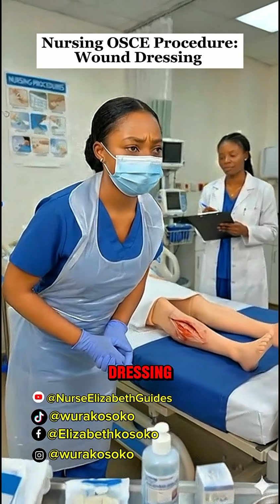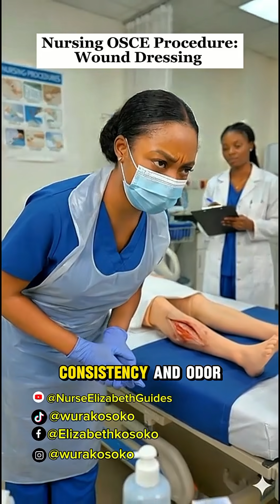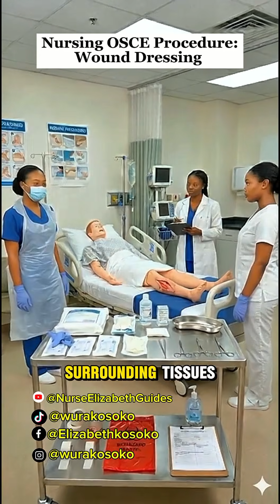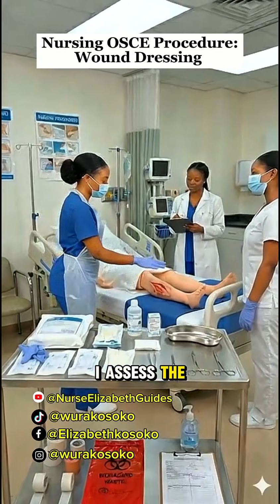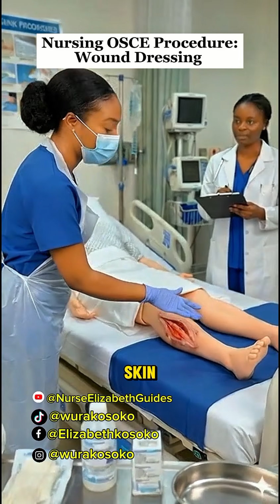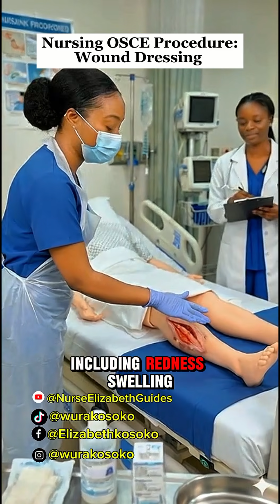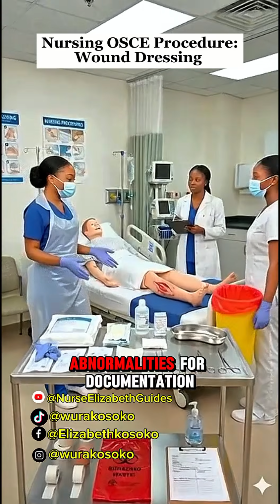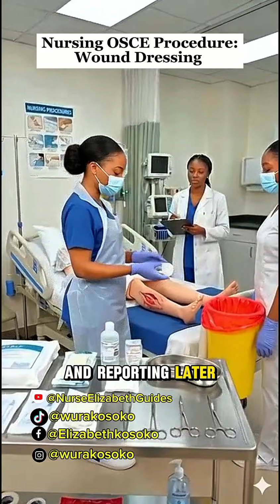While removing the dressing, I observe the amount, color, consistency, and odor of any exudate. I inspect the wound bed and surrounding tissues. I assess the wound size, depth, appearance, and condition of the surrounding skin. I look for signs of infection, including redness, swelling, heat, pain, and purulent discharge. I note any abnormalities for documentation and reporting later.